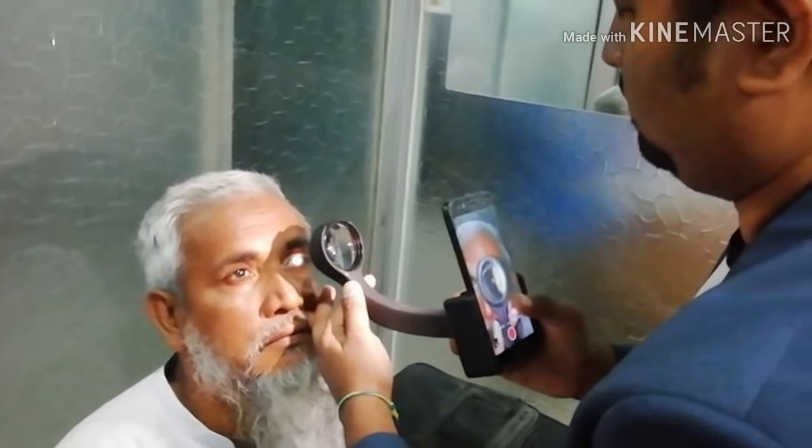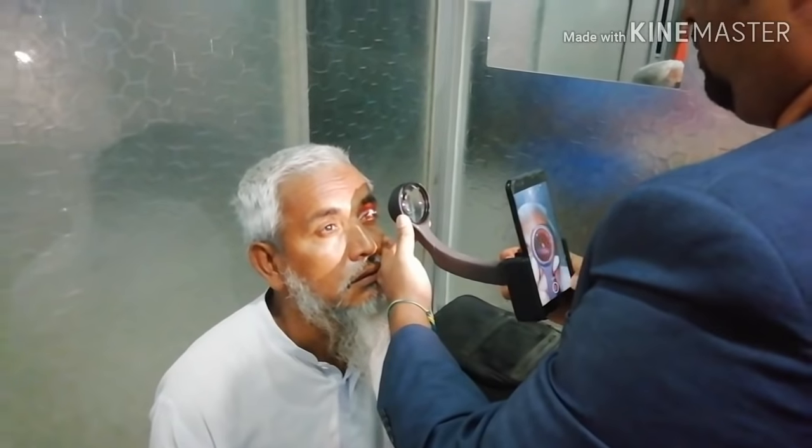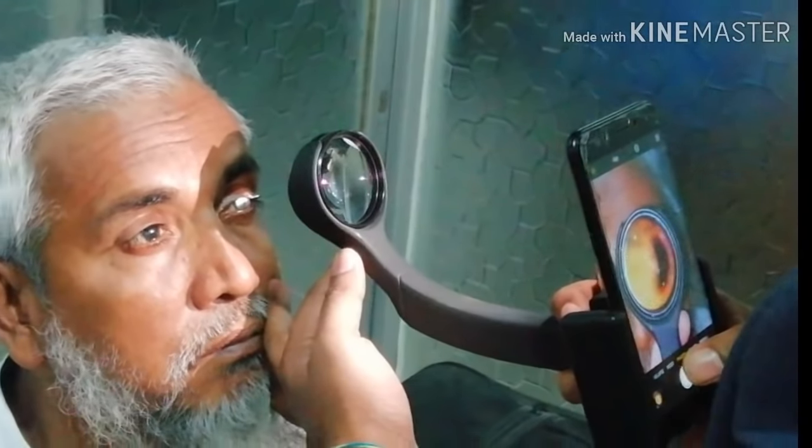You can focus easily with this device. When the diffuse flashlight passes through the 20D adapter lens and becomes a pinpoint over the cornea, the fundus picture comes into the mobile phone. The diffuse light from the mobile phone flashlight passes through the 20D adapter lens and focuses to a pinpoint position on the cornea.